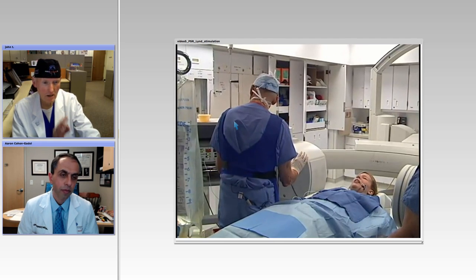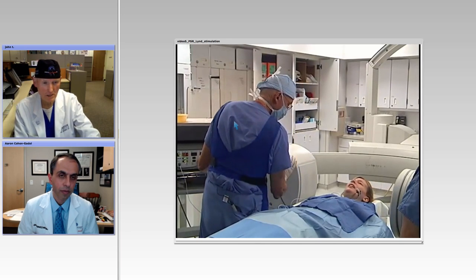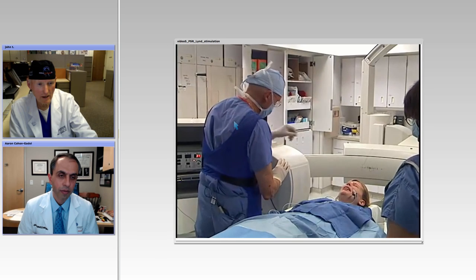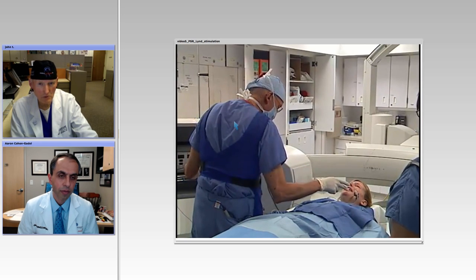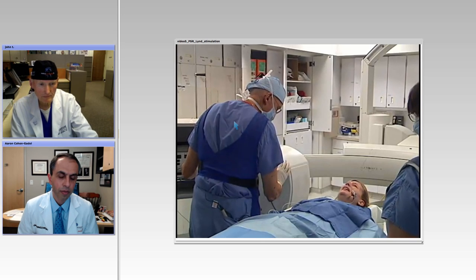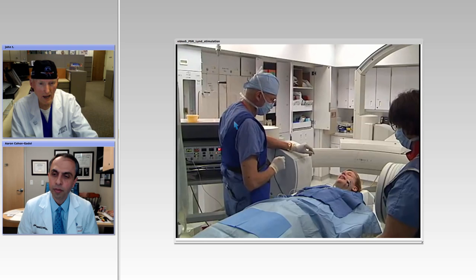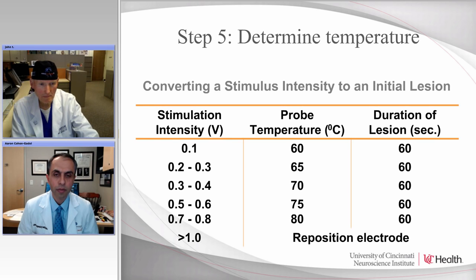And you can see that she's having a little bit of pain, which indicates that we're reproducing the pain with the electrical stimulus. So that's how we know that we're in the correct division and that we're getting a very good localization. Once we get that response, we put the patient back to sleep and make a therapeutic lesion. When patients are having severe trigeminal neuralgia, the stimulation may actually bring on an attack. So you have to be very careful about using a low voltage stimulation during this part of the procedure. And of course, that's a concern with having the patient awake.